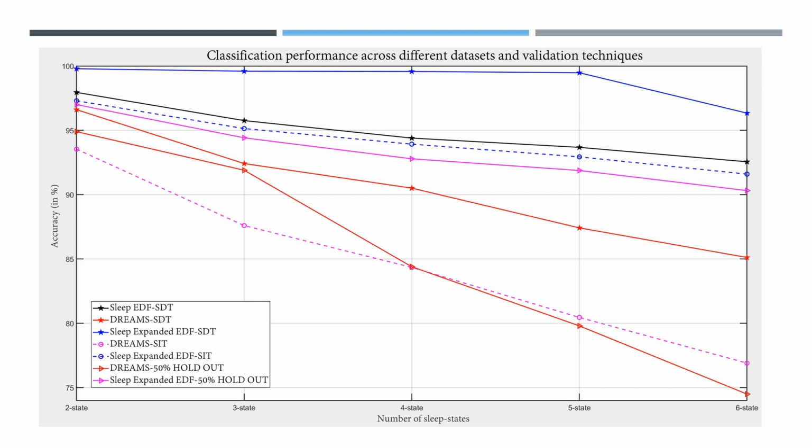SIT and holdout, both these techniques are providing almost similar results, which again shows the reliability of our method.